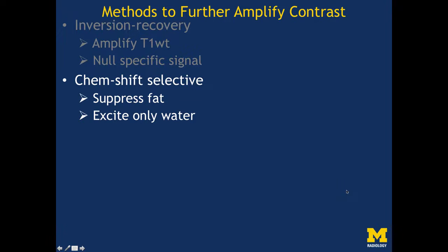I indicated we get our signal from water and fat. That's true, but they are slightly different in their frequencies. It's the chemical shift frequency. It's a 3.5 parts per million difference in the frequency between water and fat.